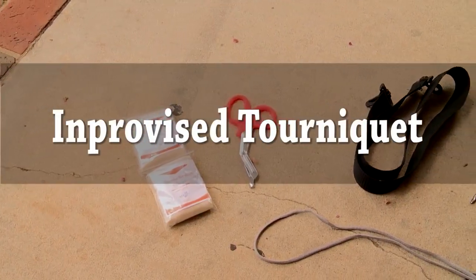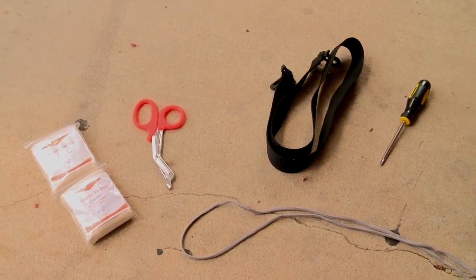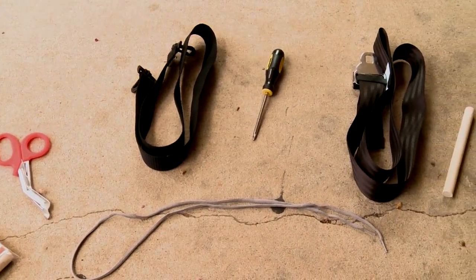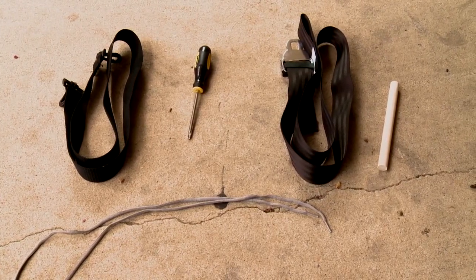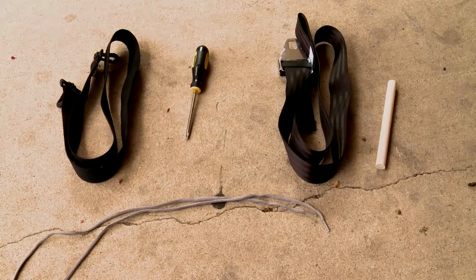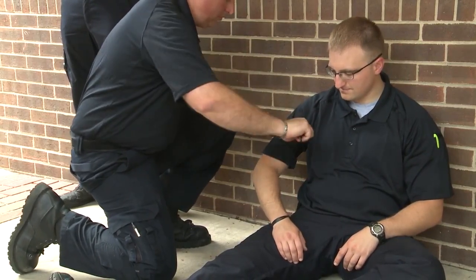Supplies that could be used to make improvised tourniquets include triangular bandages and trauma shears as a tourniquet handle, the strap from a duffel bag and a screwdriver as a tourniquet handle, a common vehicle seat belt and a section of broom handle. A common shoelace can be used to secure the tourniquet handle once desired tightness is achieved. The tourniquet strap should be made of a cloth or strap that is at least one and one-half inches wide.